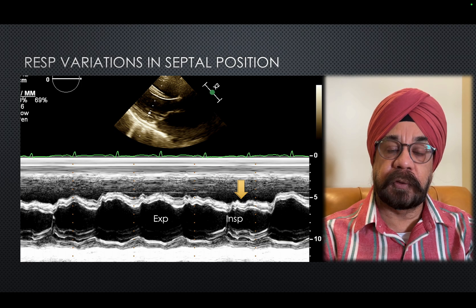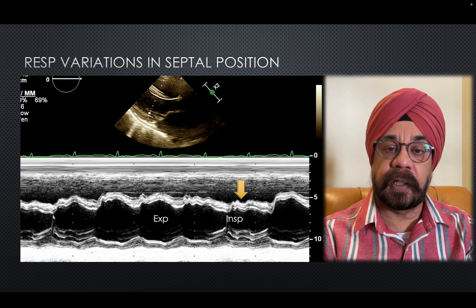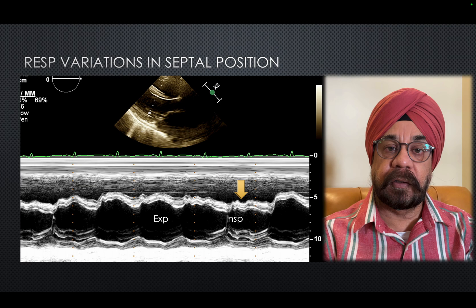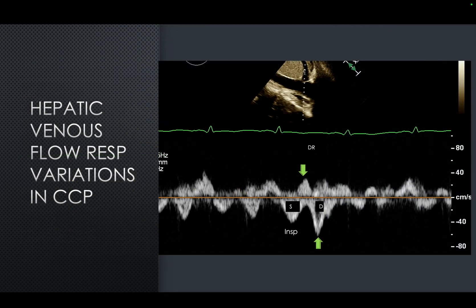This septal movement is a very specific sign with a specificity of more than 90%. The reason it happens is interventricular dependence — the ventricles are encaged in a very thick pericardium which does not allow them to enlarge independently. When blood fills more on one side, it tends to push the septum toward the other side.